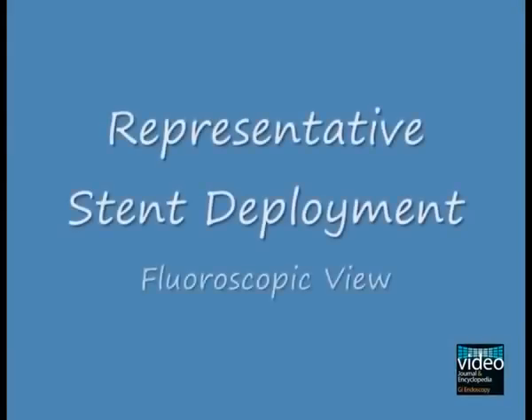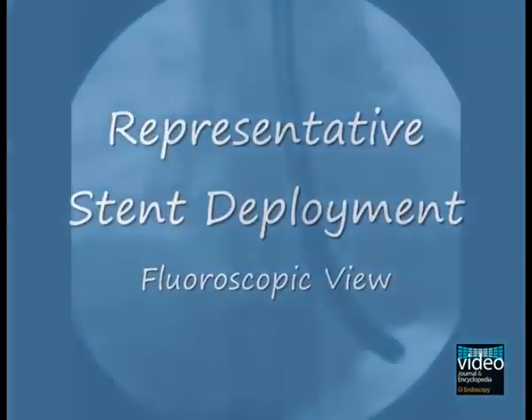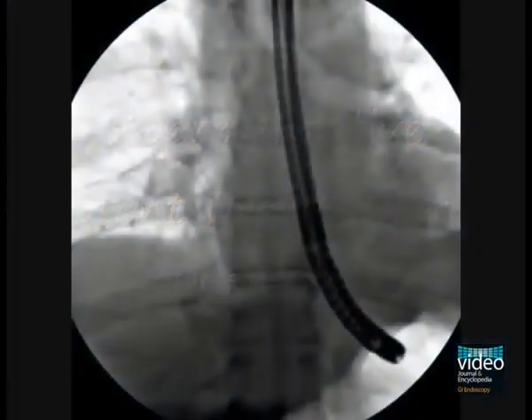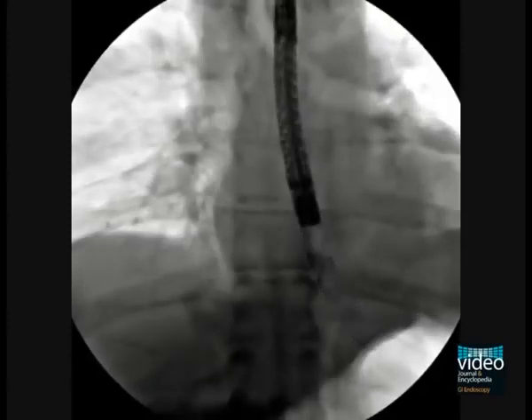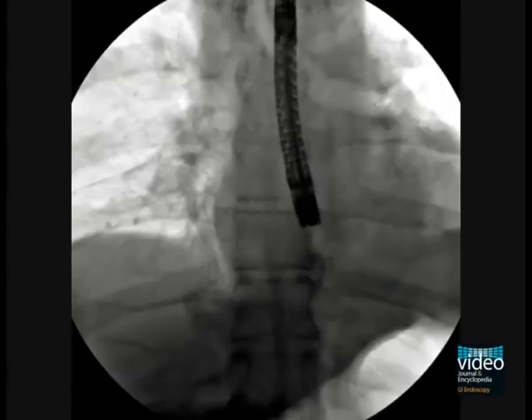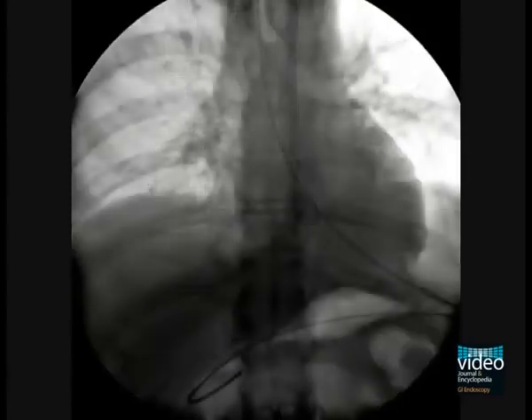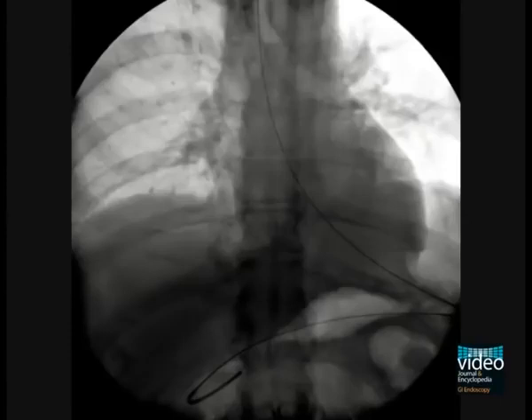A representative stent deployment will now be shown emphasising the fluoroscopic view. In this patient, the endoscope could be advanced through the tumour to the distal portion of the mass into the gastric cardia. This position is marked endoscopically with an image. The endoscope is then withdrawn to the proximal aspect of the tumour and an image is also obtained. Thus, the distal and the proximal end of the stricture are then clearly marked.